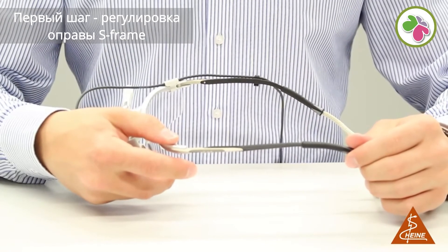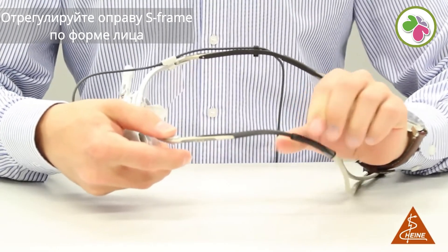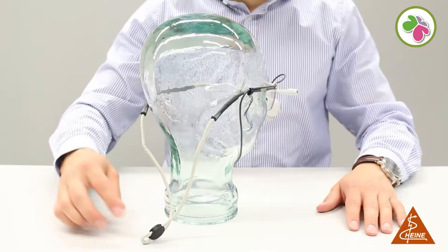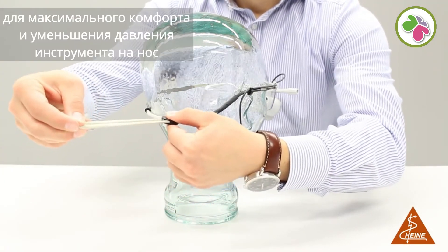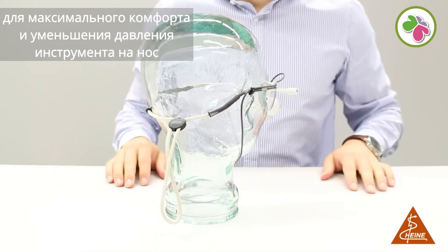Step one: adjustment of the S-frame. Adjust the S-frame to the shape of your face. Temples and nose pads can be adjusted individually. We recommend tightening the retaining cord on the back of your head to maximize comfort and to reduce the weight of the instrument on your nose.